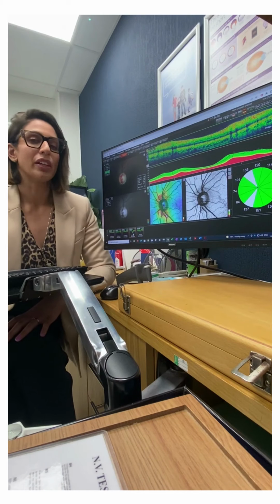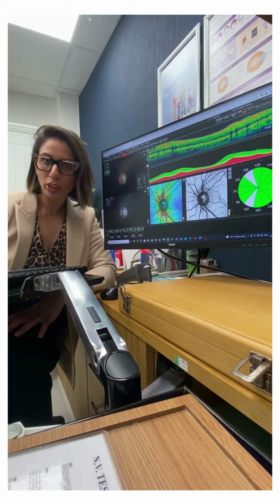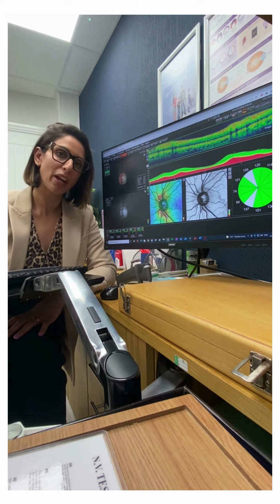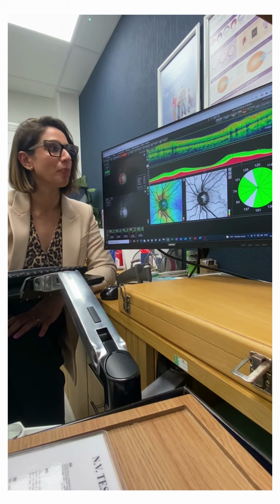The optic nerve is very unique to each eye, almost, or some might say even more unique than a fingerprint, so no two are the same in terms of their unique structure, topography and contour. So the instrument takes a photograph of the optic nerve structure itself, but in the same way as I demonstrated, we get these slices of the retina in this new location.